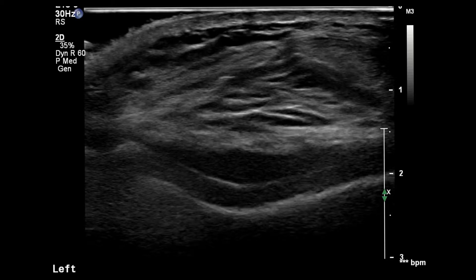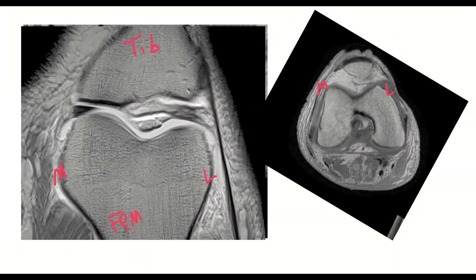In this particular video of the injection, you can easily see that the visco supplement has created a very strong border and filled up the femoral notch. If you're having any trouble visualizing or conceptualizing this particular approach, I've outlined a few MRI sequences that can be helpful.